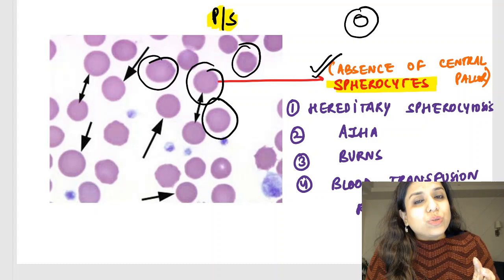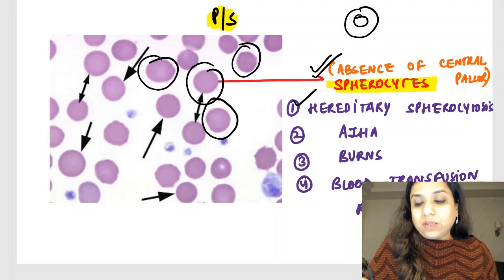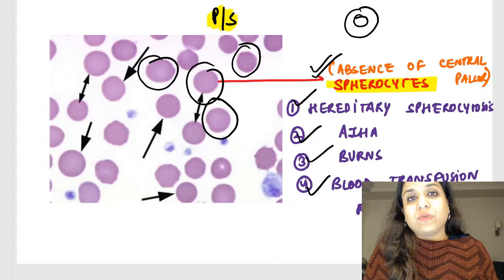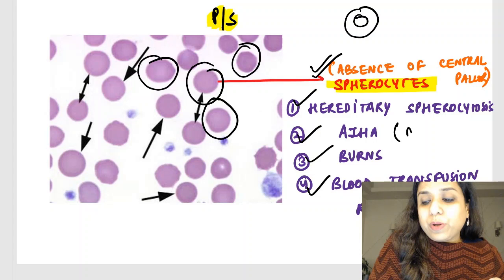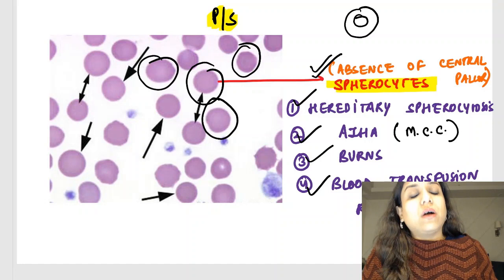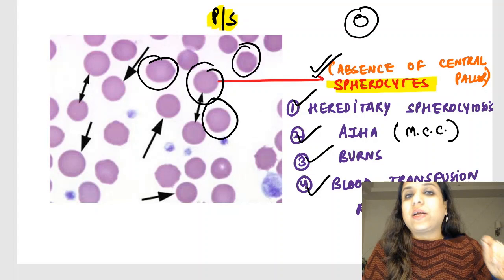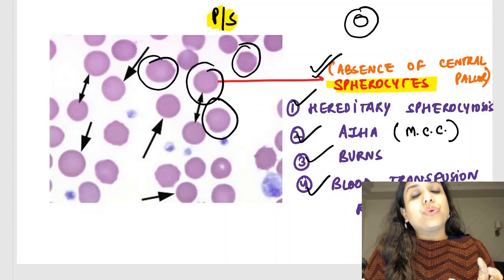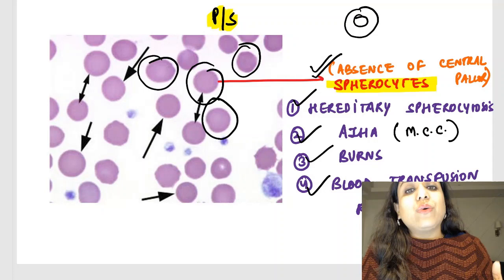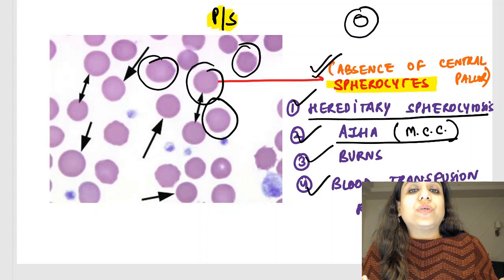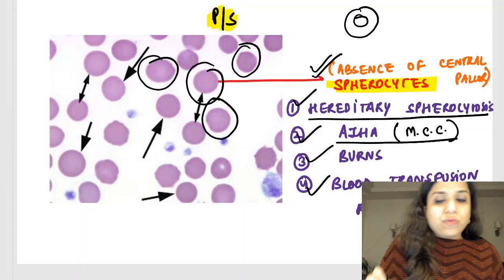Where will you see spherocytes on a peripheral smear? Whenever I see spherocytes, I have to think of four things in the differential diagnosis: hereditary spherocytosis, autoimmune hemolytic anemia, burns, and blood transfusion reaction. Now if the examiner asks you what is the most common cause of spherocytosis on a peripheral smear, the answer is not hereditary spherocytosis but autoimmune hemolytic anemia. Sometimes the examiner can give this peripheral smear and ask what test you will do. You will do both the osmotic fragility test and the Coombs test. If the Coombs test is positive, go towards AIHA; if the osmotic fragility test is positive, go towards hereditary spherocytosis.